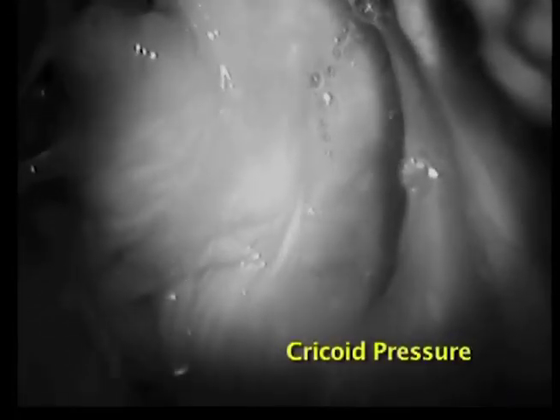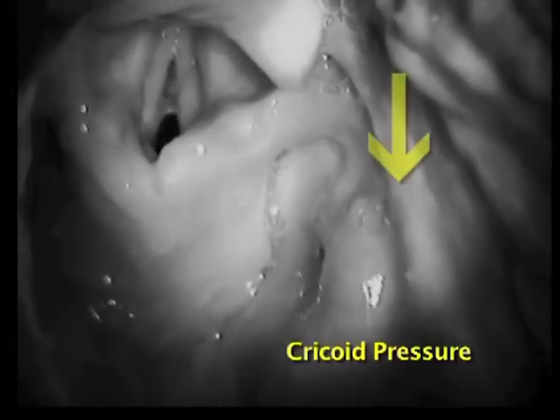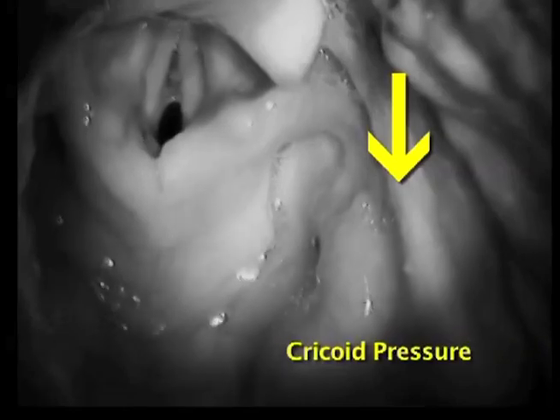Here is a view of the larynx during laryngoscopy as the assistant applies cricoid pressure. Notice how cricoid pressure brings the larynx down and into the field of view.